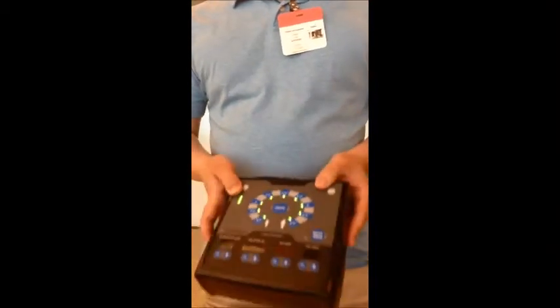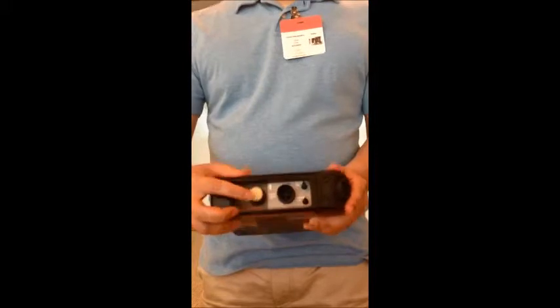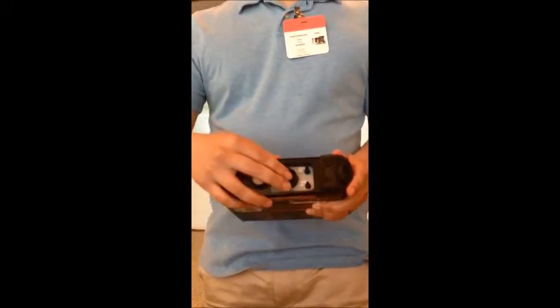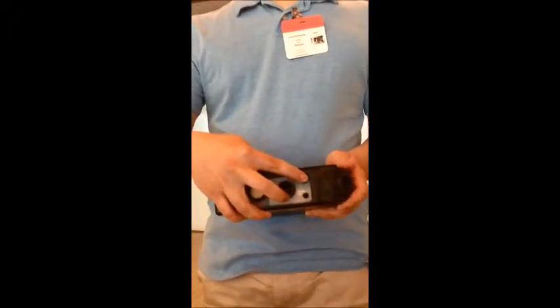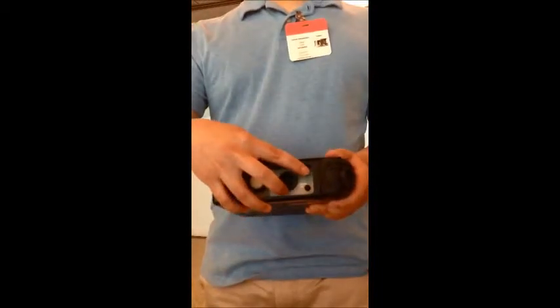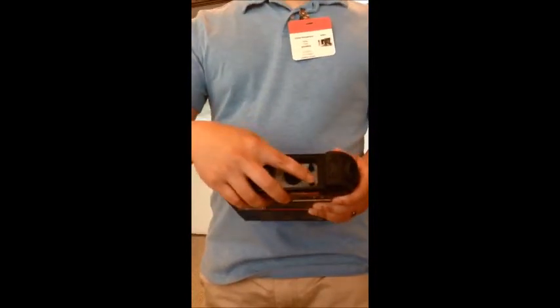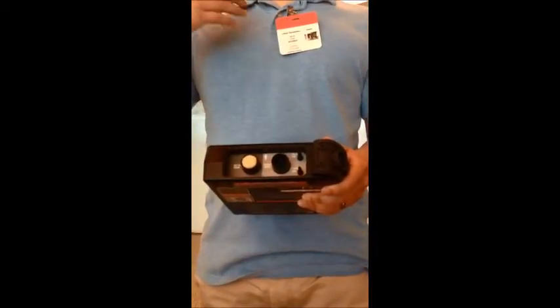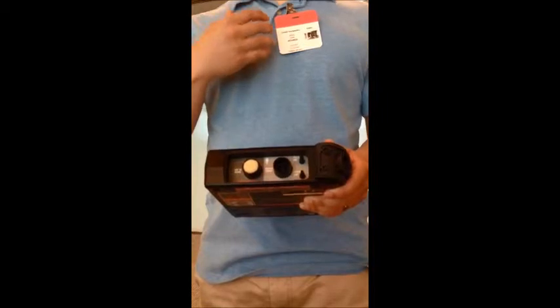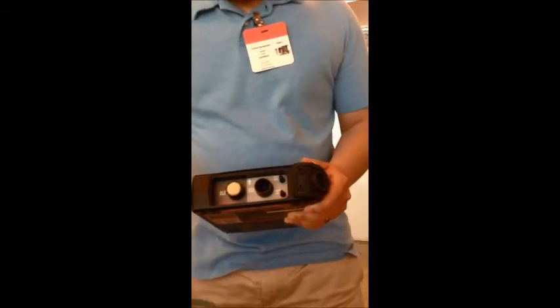So for our purpose, we're going to hook up the patient breathing circuit. There are a few ports in the back. You have an air intake port. This is where ambient air is pulled into the ventilator. And you have 3 ports over here. This is the patient circuit tubing. This is what the air is going to the patient. You have the pressure line that is monitoring near the patient airway to make sure that you are delivering an adequate amount of pressure to the patient, as well as making sure you're not delivering too much pressure. And then you have a control line that controls the exhalation valve on the patient breathing circuit. So that'll control when the patient is allowed to exhale, as well as being able to dump the air if too much pressure is being kept within the circuit, or to maintain PEEP if necessary. So we'll hook this up first.